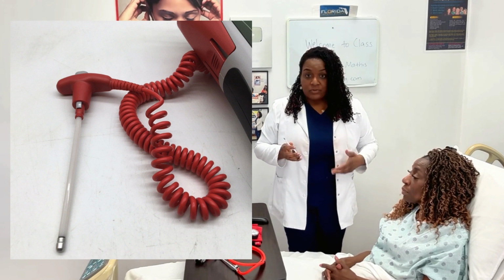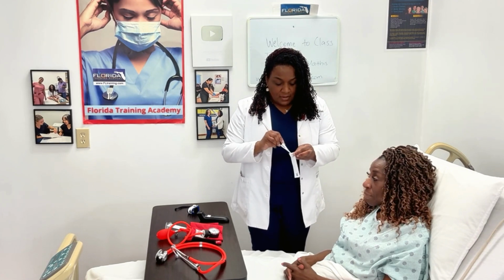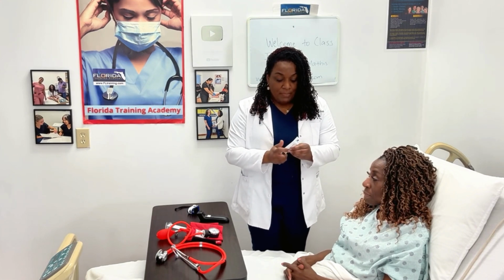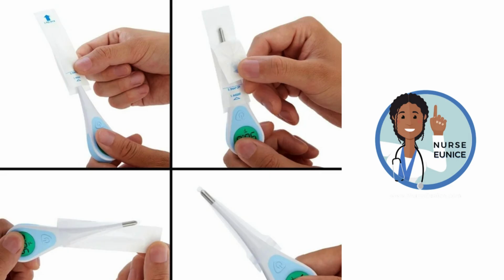So this is what we have today. We have a forehead scanner, and we also have a thermometer that has an oral probe. Whenever you are using a thermometer with an oral probe, your facility may have one that has a blue tip or one that has a red tip. I want you to remember that red is for rectal, so do not use the red tip on your patient. It is going to be the one that has the blue tip. The way that we keep this clean is that we put a probe cover on top of it. We insert it, and it says there, insert number 1. Then number 2, we peel back, and when we peel back, we will expose the covered thermometer.